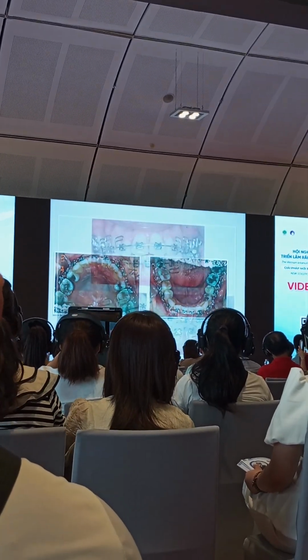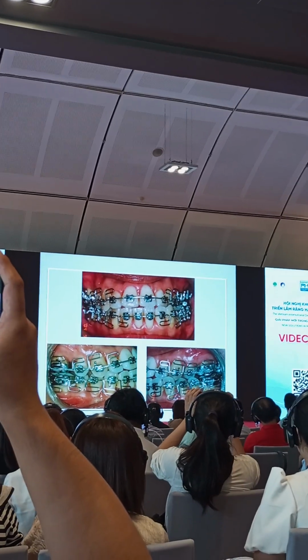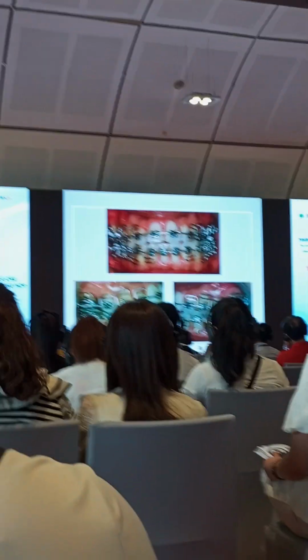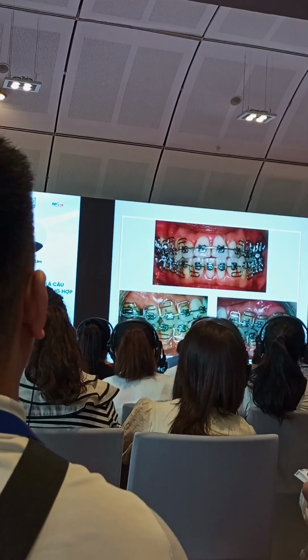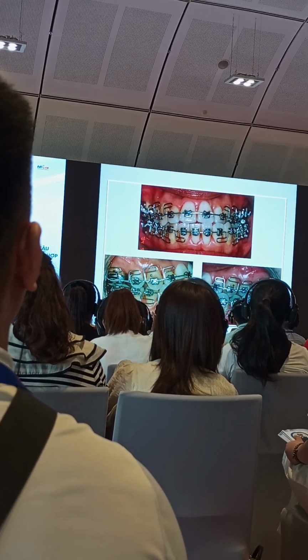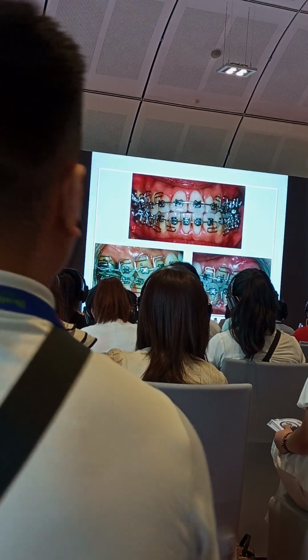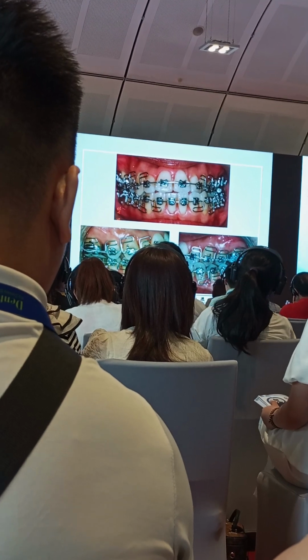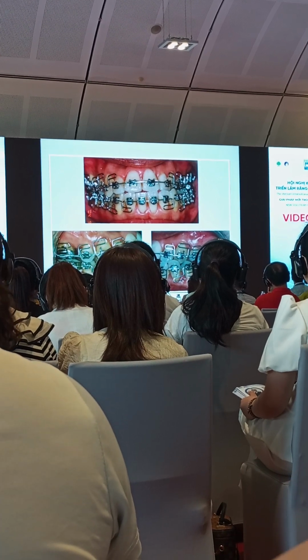This is the occlusal view. So she came back again. The bite is already almost edge to edge. So I activated it again, I did the space closure, and then continued again with the elastic wear. There's still crossbite here. I tried to expand using the wire only, and I did not use any Mulligan because I'm afraid that when she leaves, with the Mulligan wire there, it might overexpand the arch. So I just need to expand using the wire so that I can control it because I don't know when she will come back again after the adjustment.